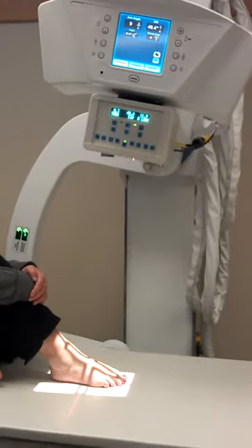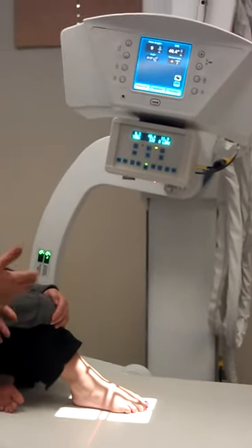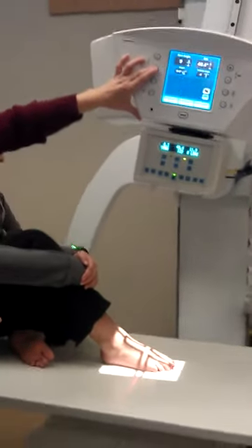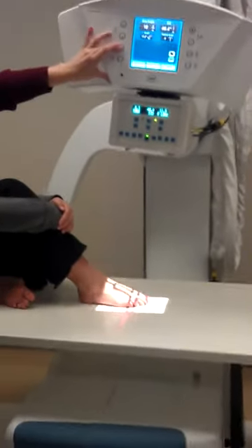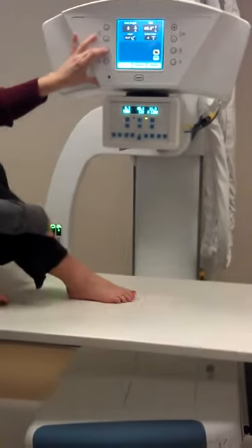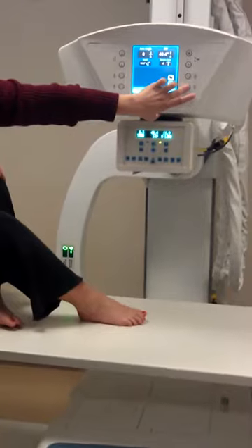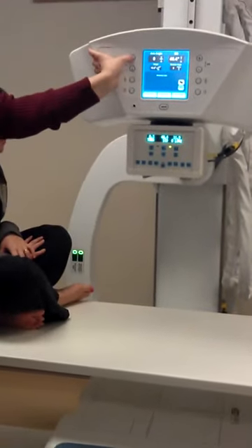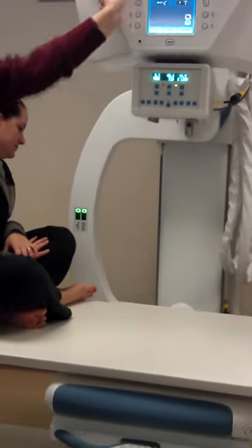Any questions on how to angle for the foot? So we lower first, then we angle back, then we straighten it out, then we go back up — and try not to hit the table.